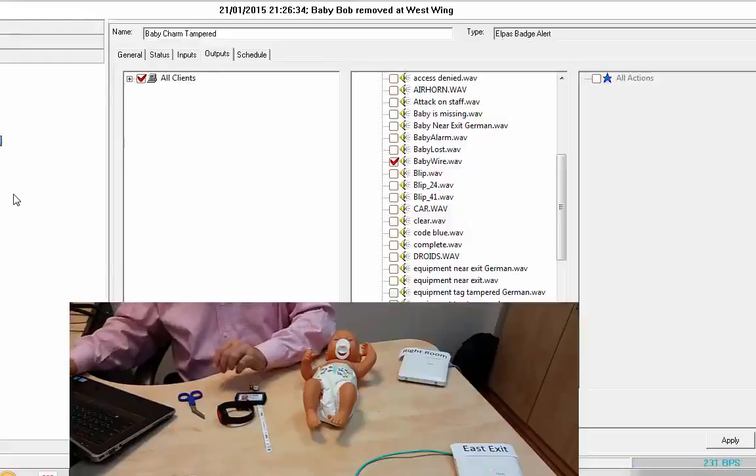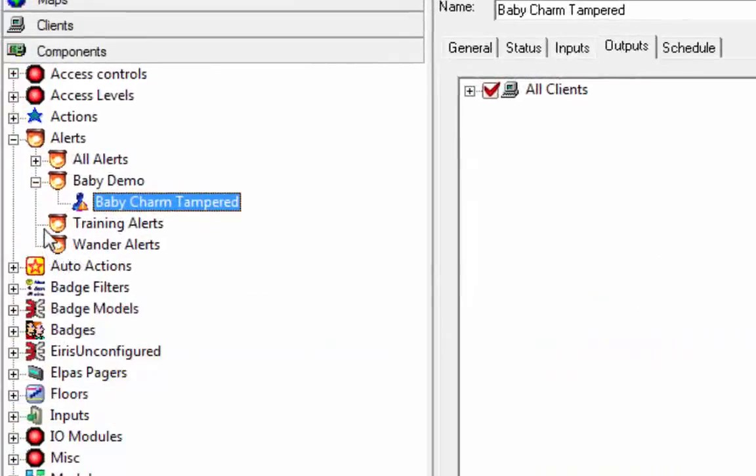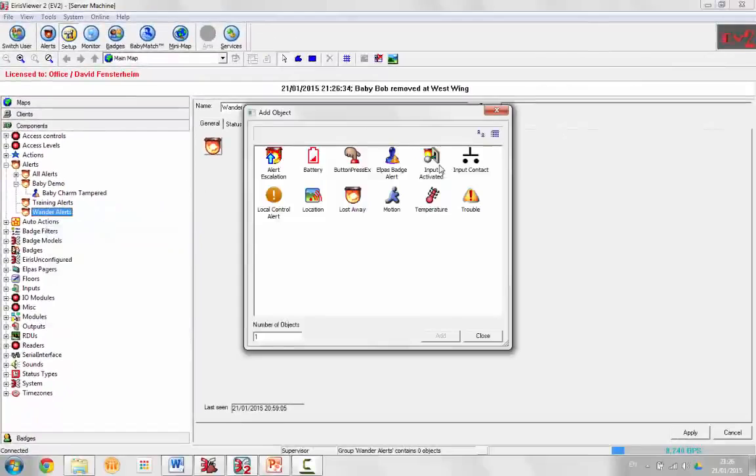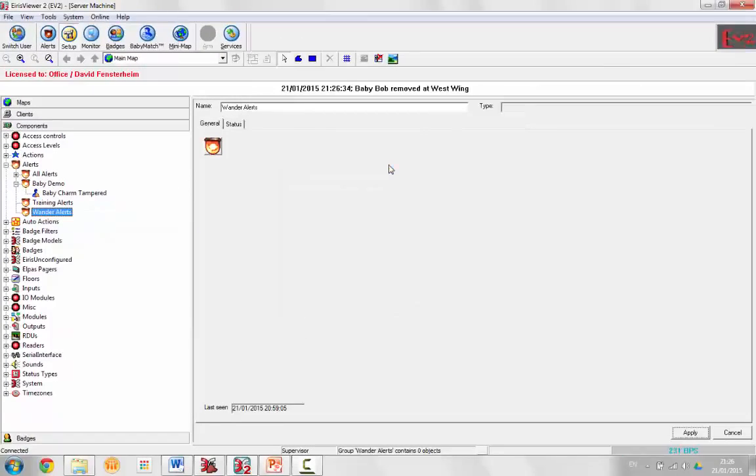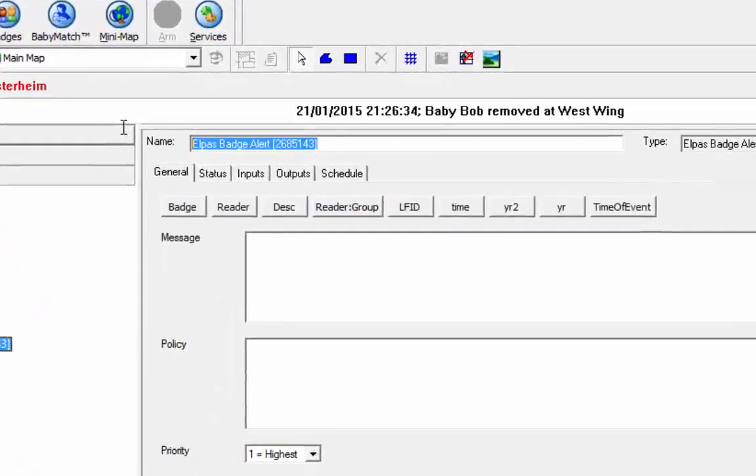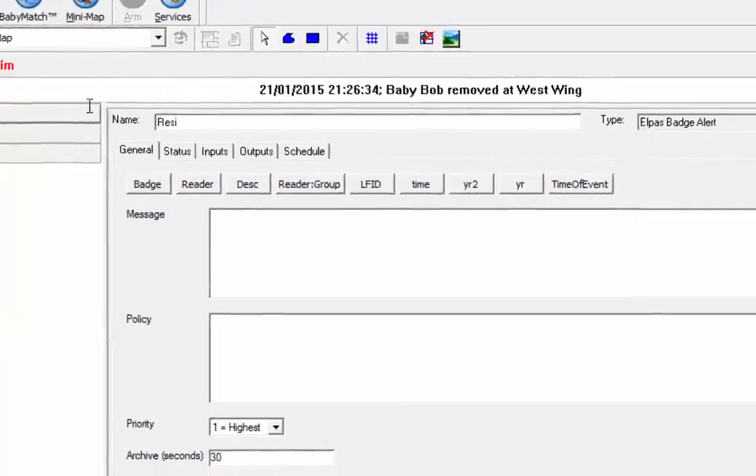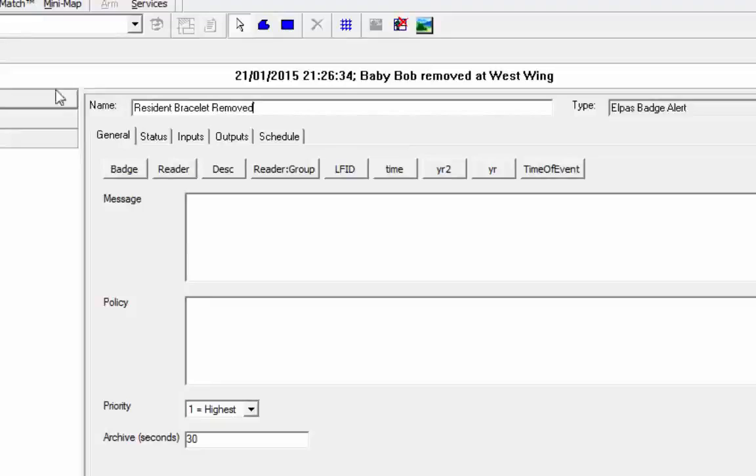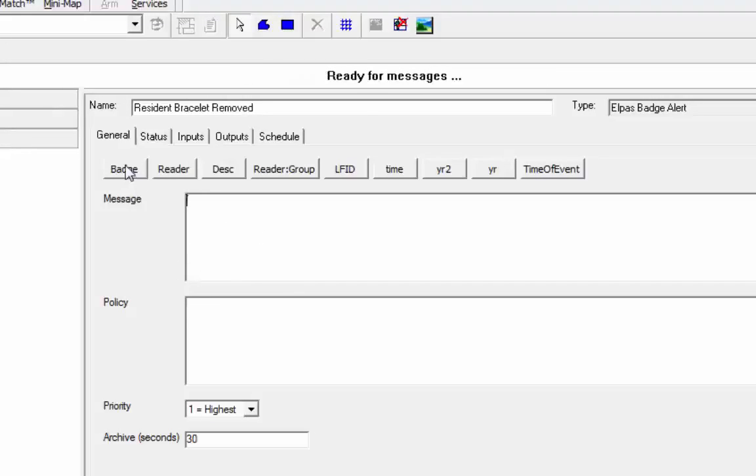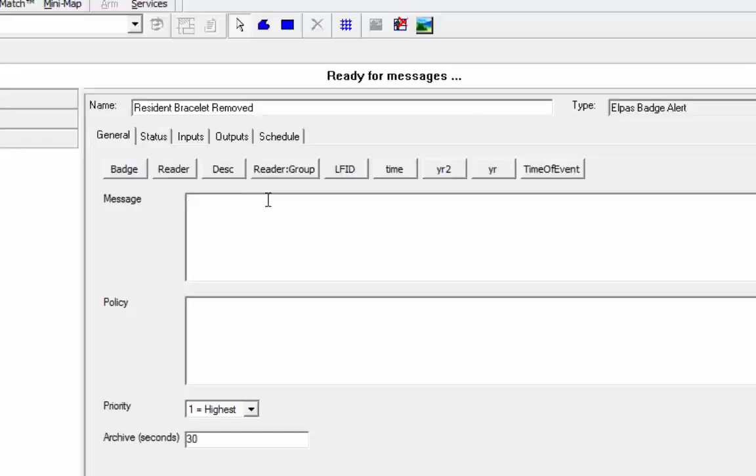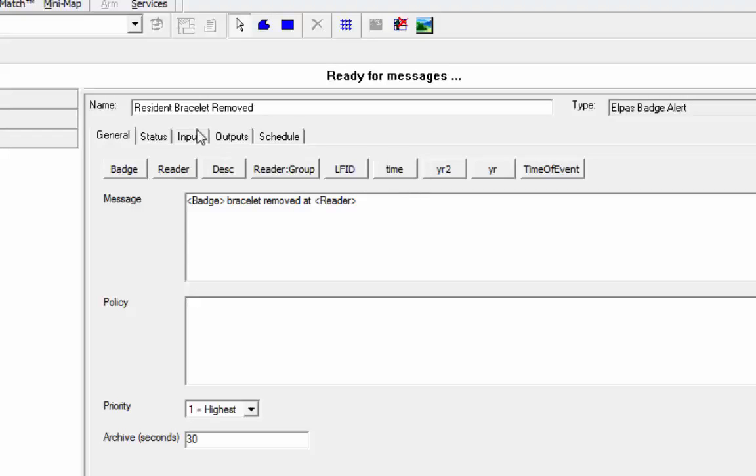Similarly, for the resident tag, let's go to Wander alerts, add by type. Also, ELPAS badge alert. This is resident bracelet removed. So we can do band bracelet removed, add reader. Apply that.